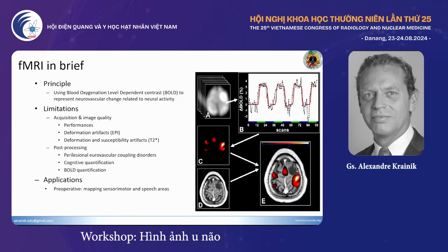And finally, fMRI. Everybody knows fMRI, one of the sexiest techniques that was invented, well, now more than 30 years ago. The idea was to monitor the temporal change of oxygenation and perfusion of the brain of each voxel along time when we ask people to be at rest and sometimes to move, for instance, here, to move the right hand, and then the signal increases. And after, the subject is at rest and after has to work again and so on.